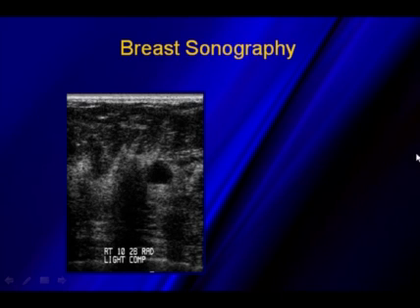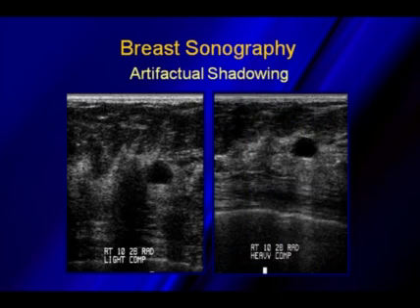If this patient has films that are read at the end of the day, she's going to be recommended for a biopsy. But this was just created by scanning with too light a pressure. Once we went back over the same area, compressed down, we can completely make that go away. So it was an artifact of just the normal fibroglandular tissue with scanning with too light of pressure.